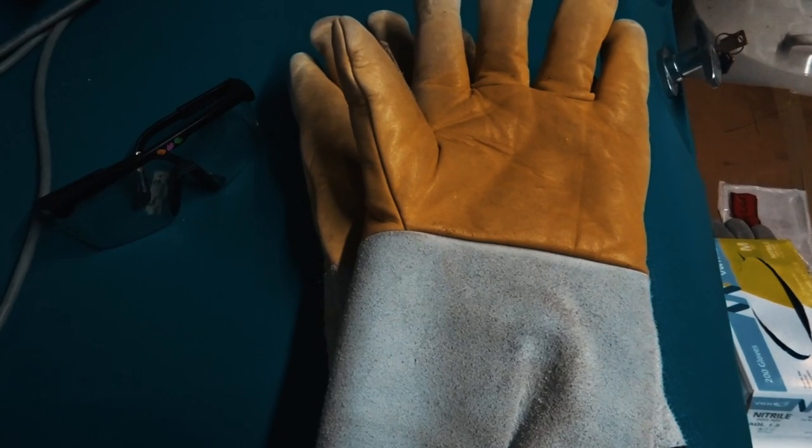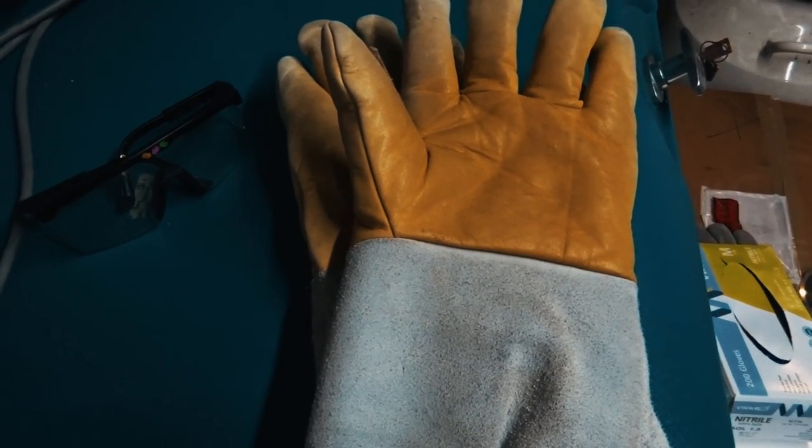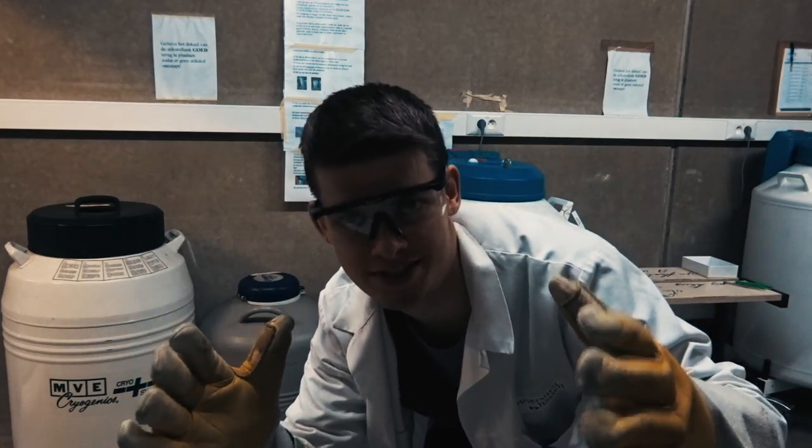I've prepared a culture media. I'm going to get the cells out of the liquid nitrogen tank, and because liquid nitrogen is not that healthy for us, we'll be wearing gloves and glasses. Always wear protection — let's do this.